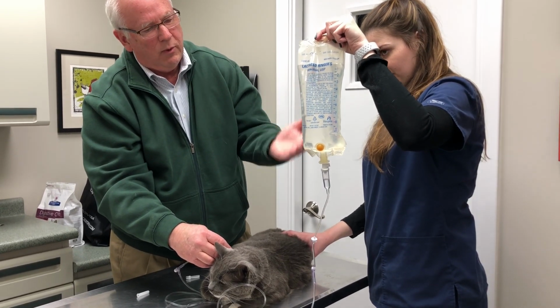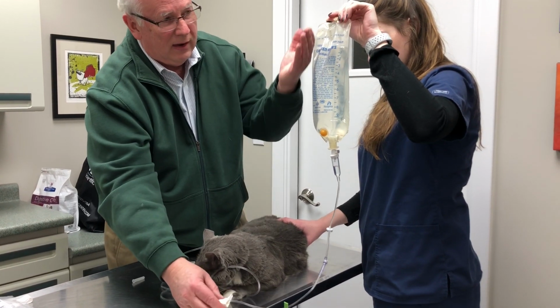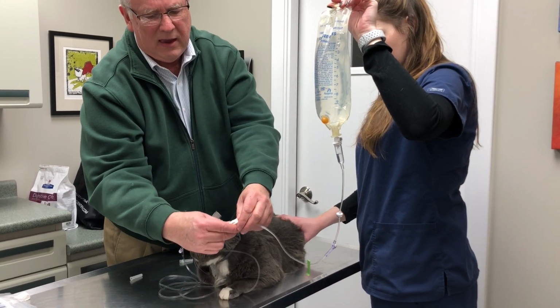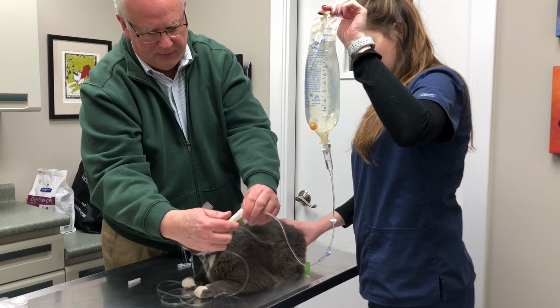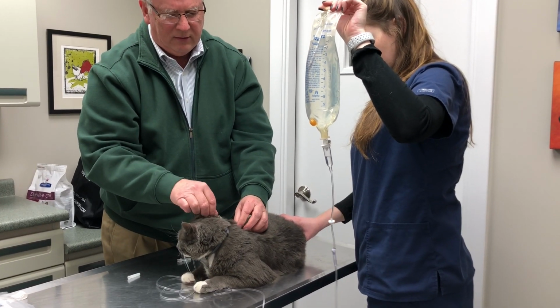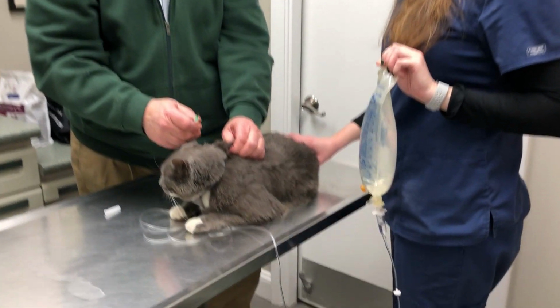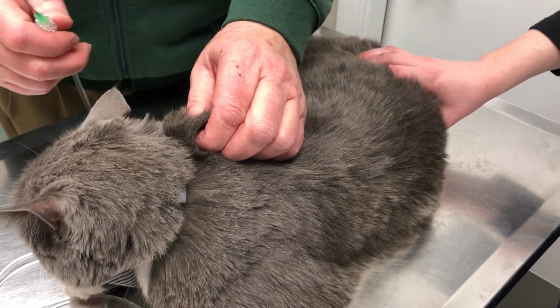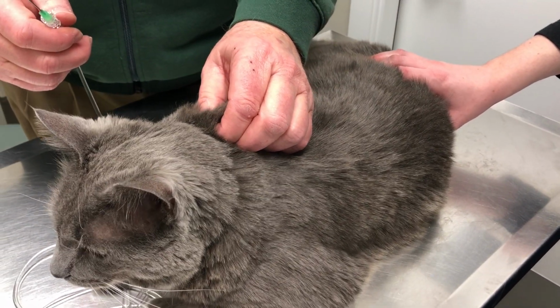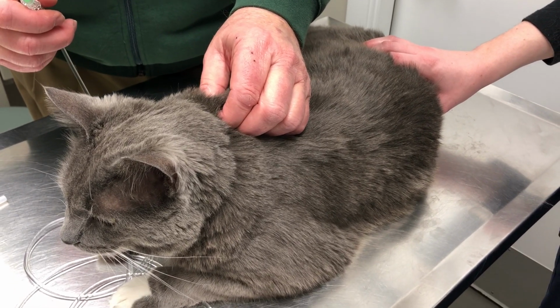And we would just simply wait until that much fluid is passed through. Then once the fluids are done, and we'll assume that we've given 100 cc's to Manny, we're going to close this off so that the fluids stop. We're going to remove the needle from Manny. We're going to kind of pinch off where we stop giving, because sometimes the fluids will leak through that little hole once we do it. So we're just going to kind of pinch that off a little bit. You can see Manny doesn't really care.